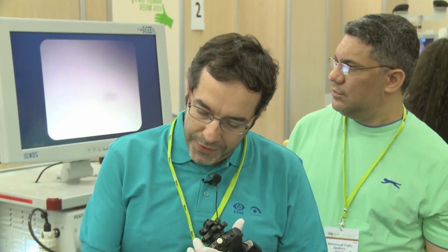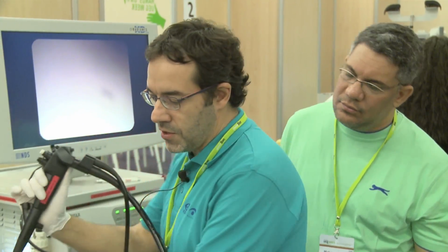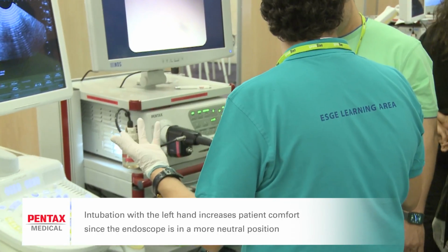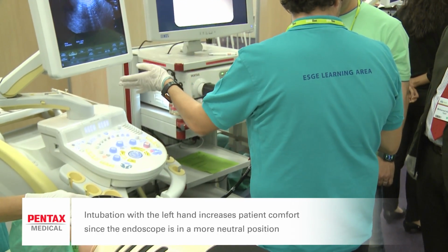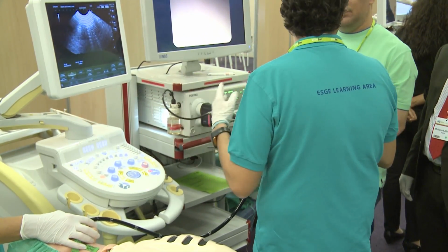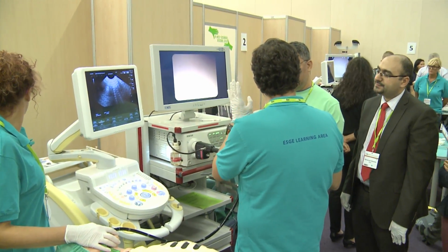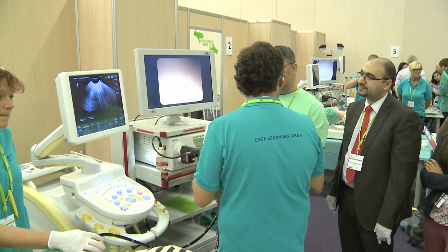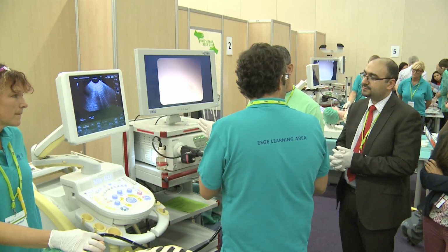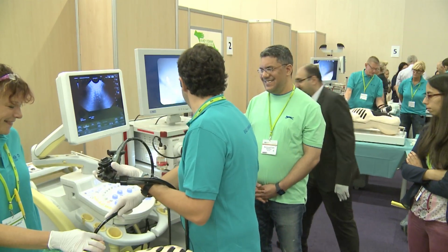To intubate with the right hand, you need to have the scope very torqued. Okay? But if you use the left hand, the position of the scope is more neutral, so it's more comfortable for the patient while you're going through the throat, accessing the esophagus. That is because we do not have a frontal image, but we have an oblique image. So I always want to see where I'm going. First I want to see the epiglottis, and then after I see the epiglottis, I want to check where the cricopharyngeus is, and then just by depressing the scope, make a slight movement inside. Okay? That's just a trick that I learned from my boss.